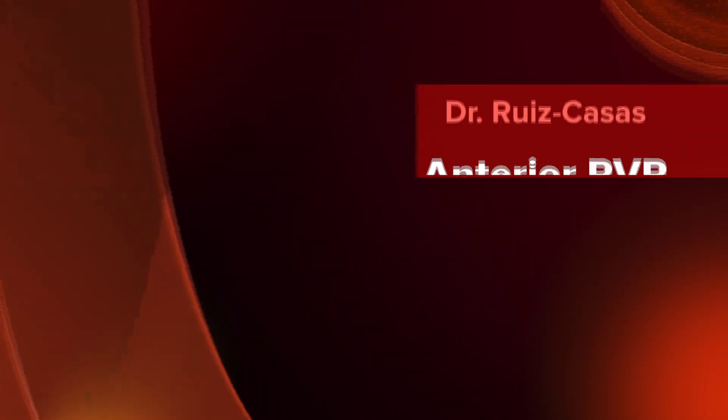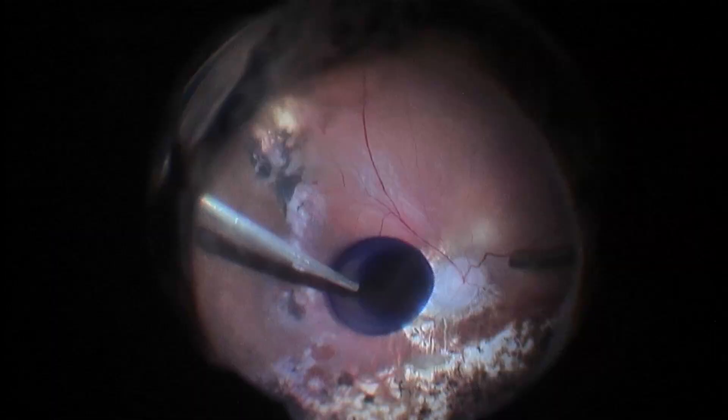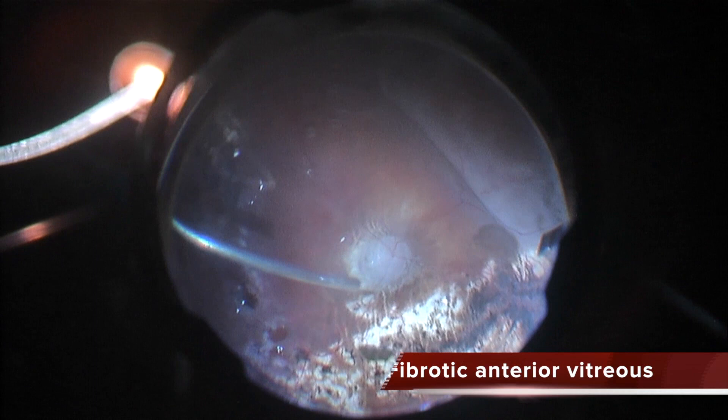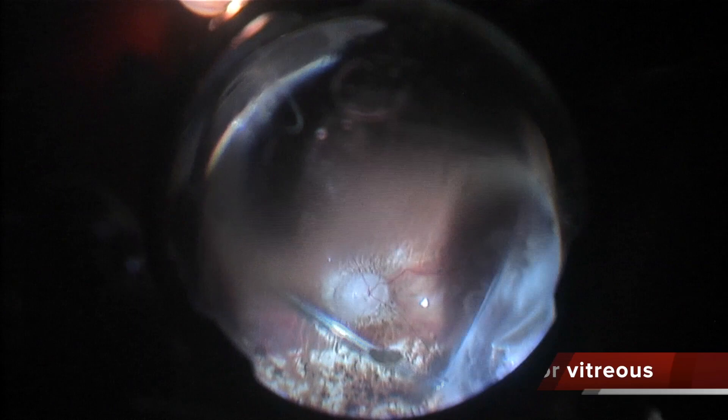This was a retinal reattachment after vitrectomy 5 years ago for another colleague. You can see the posterior border has a micro tear. The most important finding in this case is the massive peripheral vitreous remnants and fibrotic peripheral vitreous.